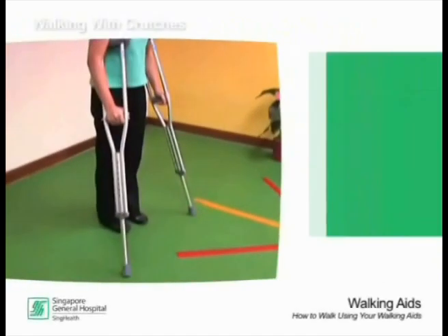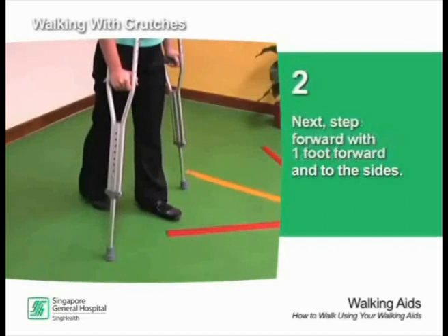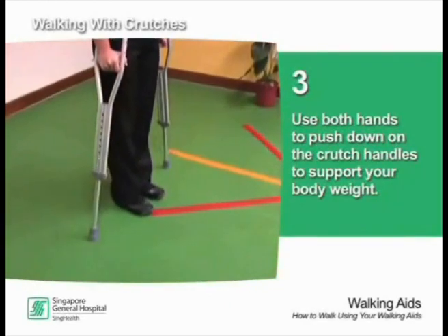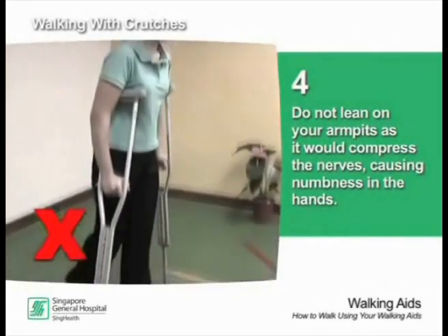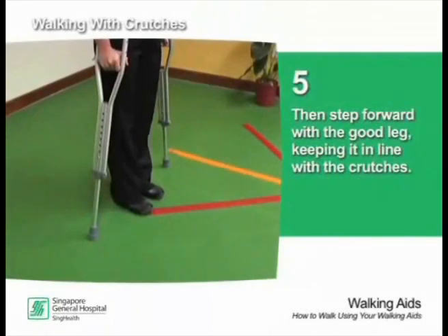When walking with crutches, place both crutches about one foot forward. Next, step forward with your injured leg. Use both hands to push down on the crutch handles to support your body weight. Do not lean on your armpits as it would cause compression, resulting in numbness of the hand. Then step forward with the good leg, keeping it in line with the crutches.